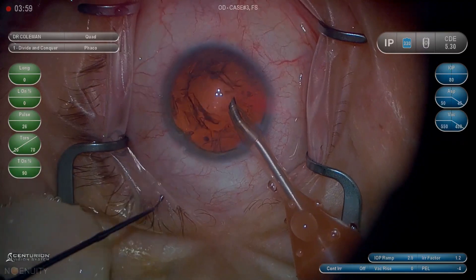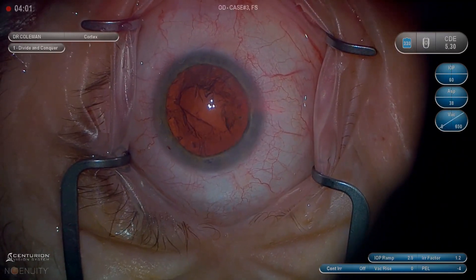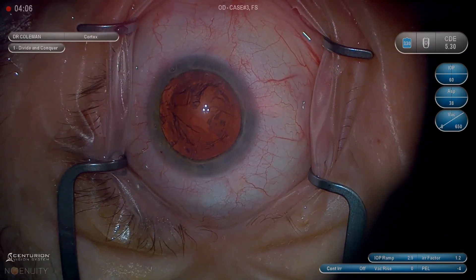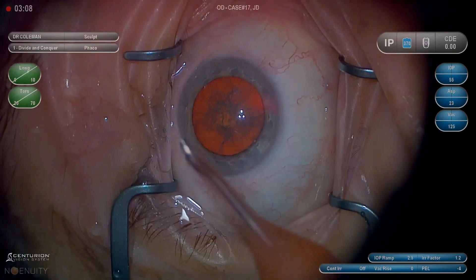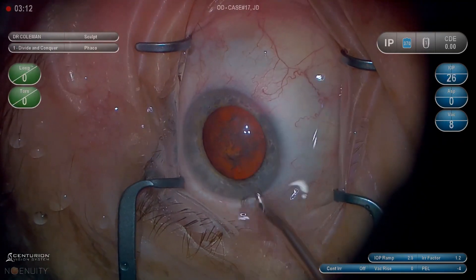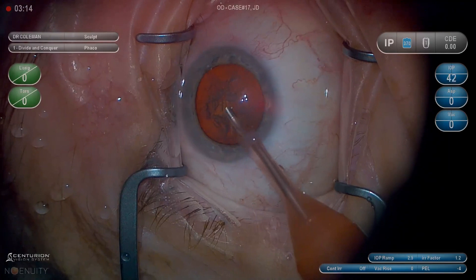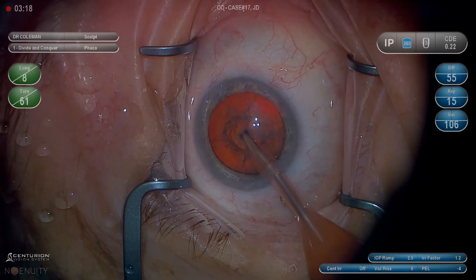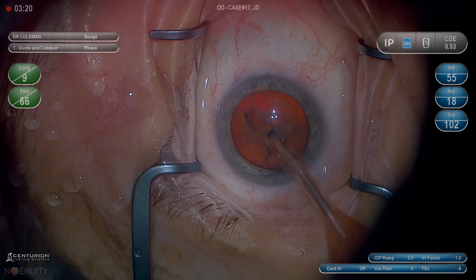One of the things I like to point out is just the entry into the eye. The problem I've had in the past is a little small endothelial tear at the main surgical wound, and I think that comes from the bevel angle as you go into the main wound. You really want to be pointed down a little bit so you don't grab endothelium and tear it off as you're going in with the phaco.